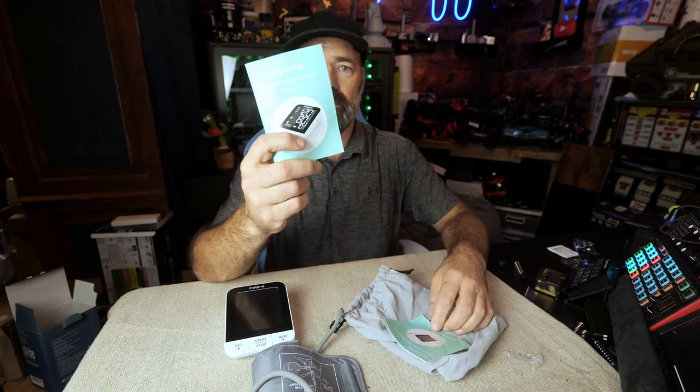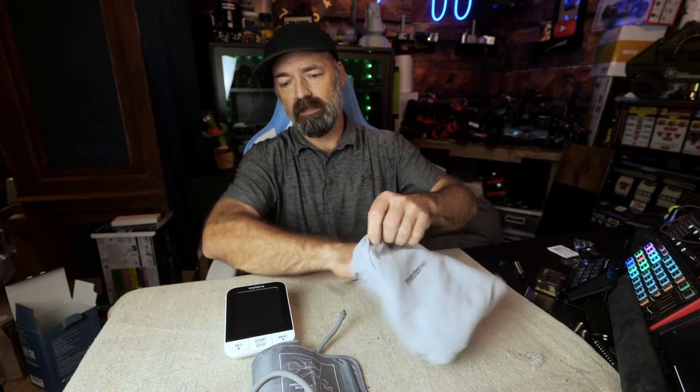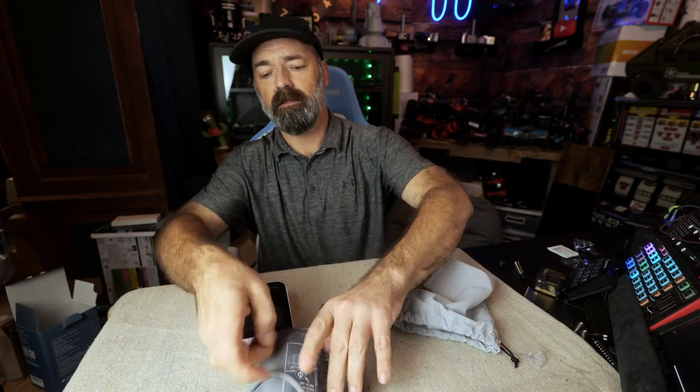It comes in a nice carrying case, and you have your instruction manual and your user manual. This tells you how to take your blood pressure and everything about the machine.